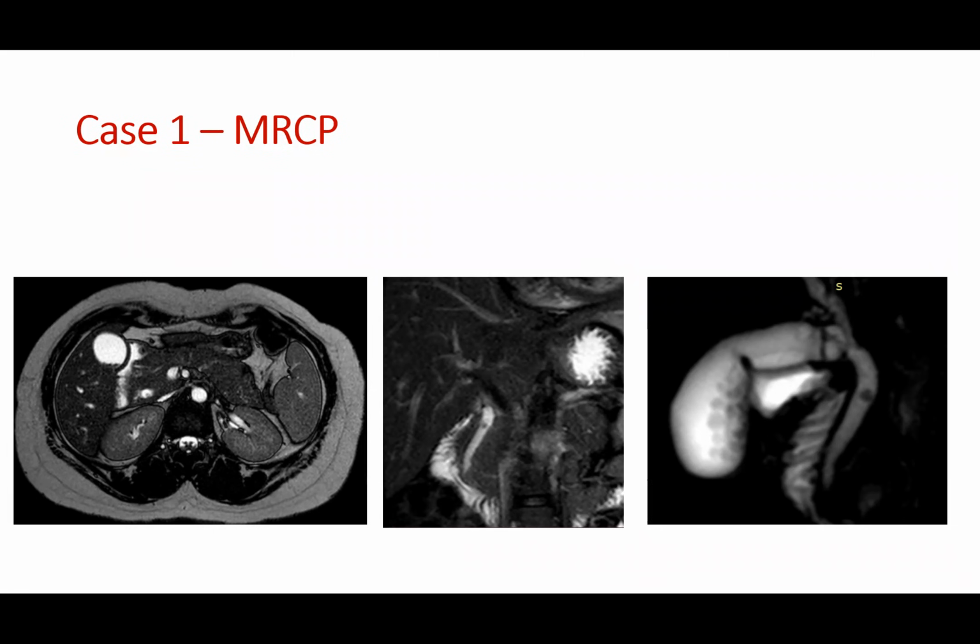The one reason is to assess the severity and the complications of pancreatitis itself. As we all know, the CT or the MRI would be a better imaging with regard to the assessment of the pancreas and its complications. The second issue is to see whether there are any other hidden calculi in the CBD, and for the assessment of the biliary system, I suppose the CT and the MRI would be more sensitive compared to the ultrasound. So what do you think, Aranda?